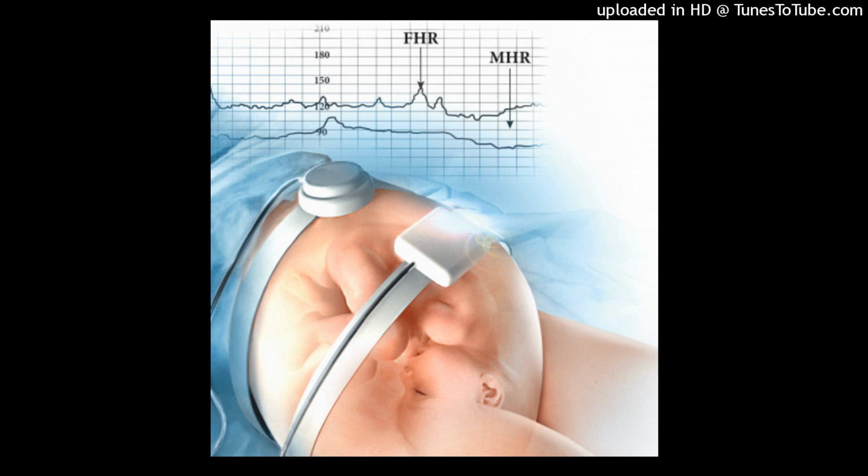Periodic and episodic fetal heart rate patterns. Periodic FHR patterns are those associated with uterine contractions. Periodic patterns are distinguished on the basis of waveform and are either abrupt or gradual in onset. Abrupt waveforms are quantified as those that have an onset to nadir, lowest point, of deceleration or peak of acceleration in less than 30 seconds. Gradual waveform takes more than 30 seconds. Episodic, non-periodic patterns may have an abrupt or gradual onset but are not linked with UA.